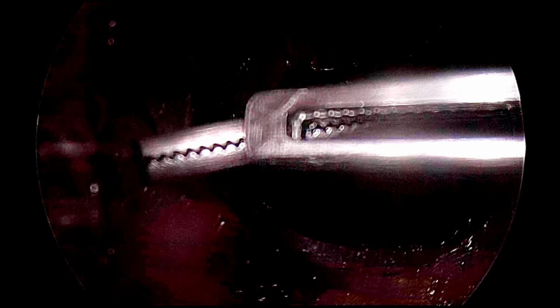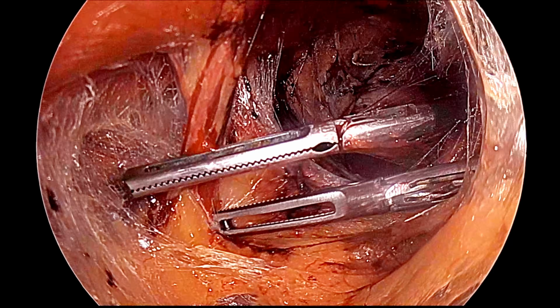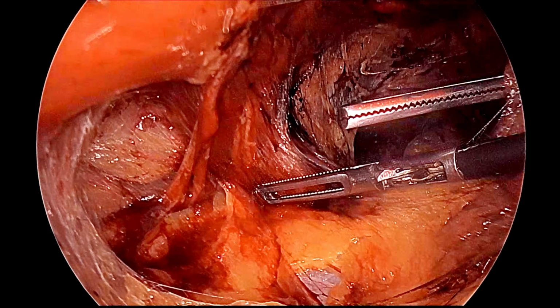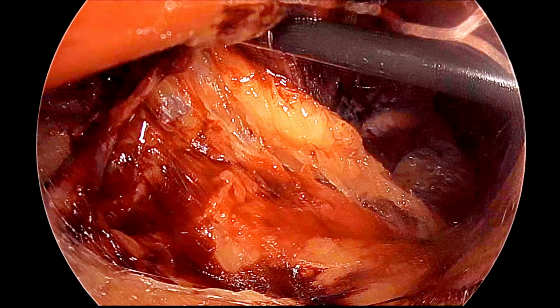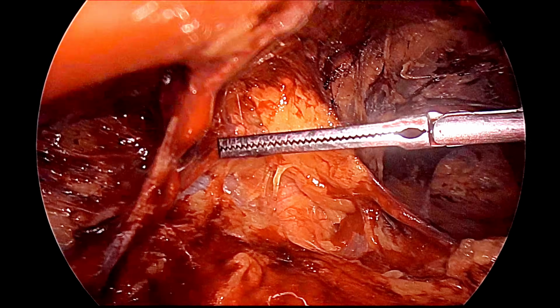and now this is the lateral dissection, sweeping movement should be done, and this is the inferior epigastric vessel. We should keep the inferior epigastric vessel towards the abdominal wall, and we should try to avoid injury to the inferior epigastric vessel, and slowly this plane should be separated.